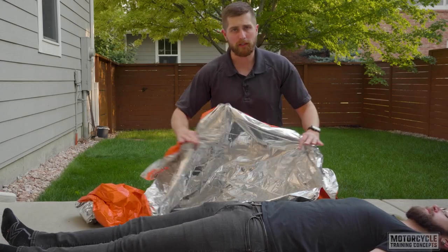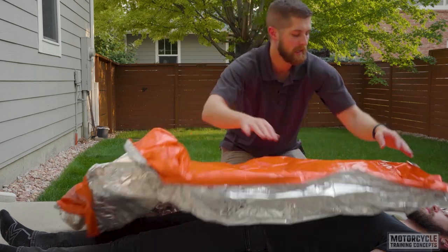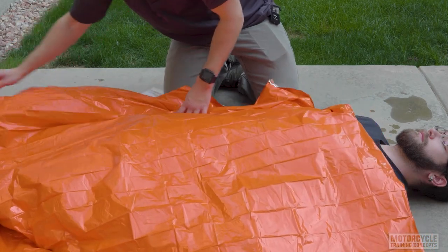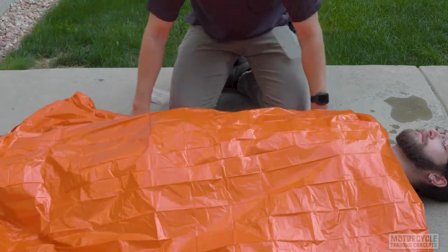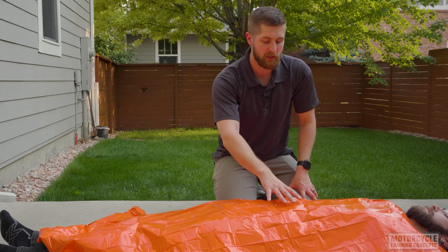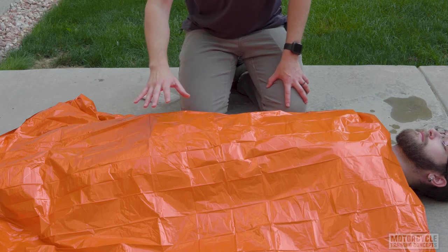For the second method, you do want something under the patient insulating them. But really simply, we can take this blanket, throw it over the patient, cover them up, and tuck the sides under them. This is going to help balloon some of that heat. But you do lose some of the ability to access the chest if you need to do a reassessment or any other procedures.